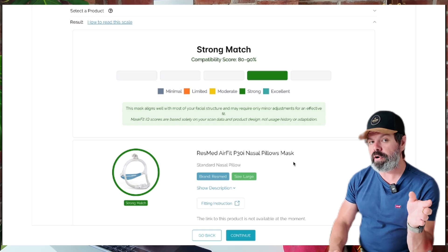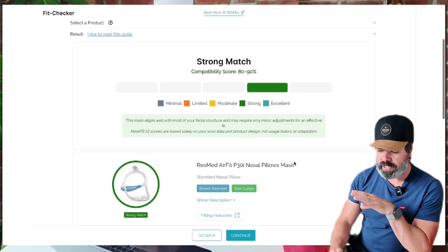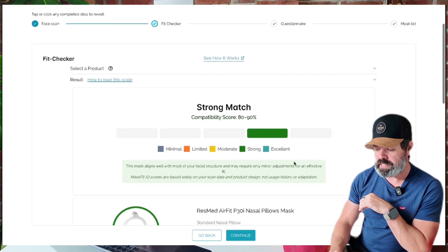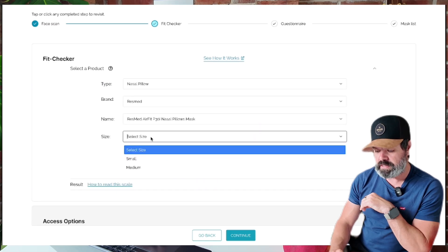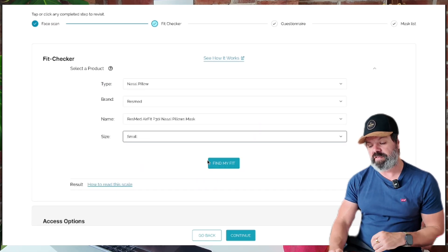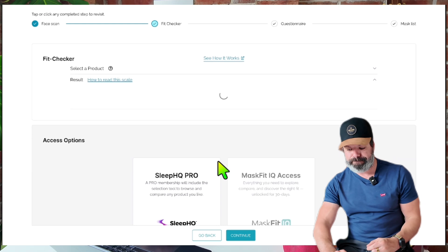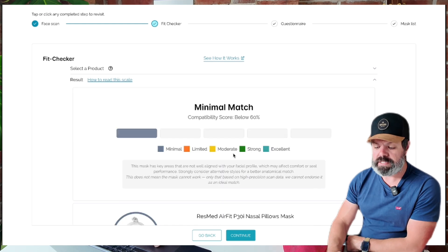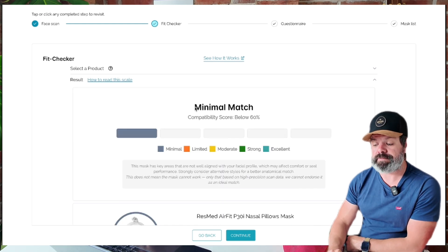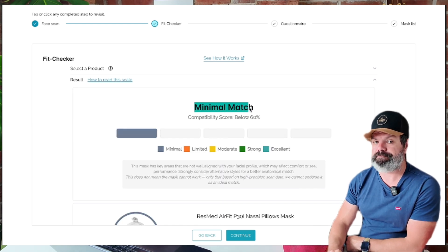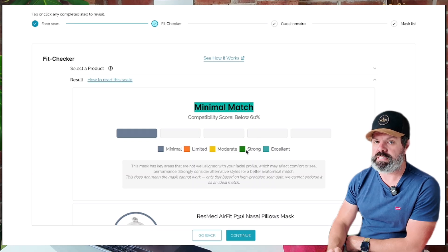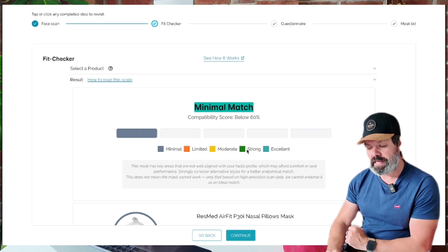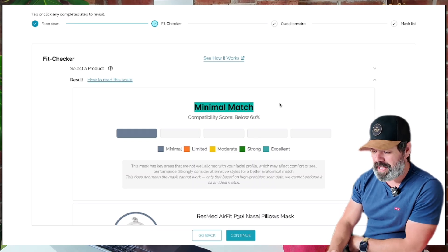Now let's say I'm currently using the small. I'll come back, select size small, find my fit — and now it's a minimal match. So I'm going from strong to minimal because it's not the right size.